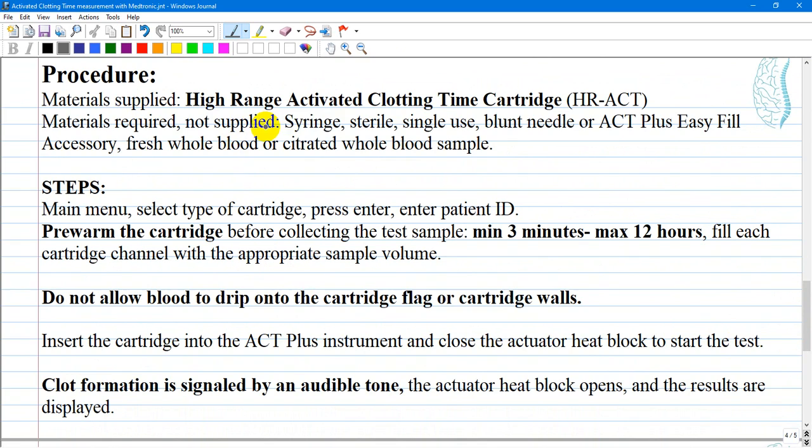Materials supplied: high range activated clotting time cartridge. We are using this type, but there are three types of cartridges: high range activated clotting time cartridges, low range, and recalcified. Materials not supplied by the apparatus include a sterile single-use syringe, blunt needle or ACT Plus easy fill accessory, and fresh whole blood or citrated whole blood sample.